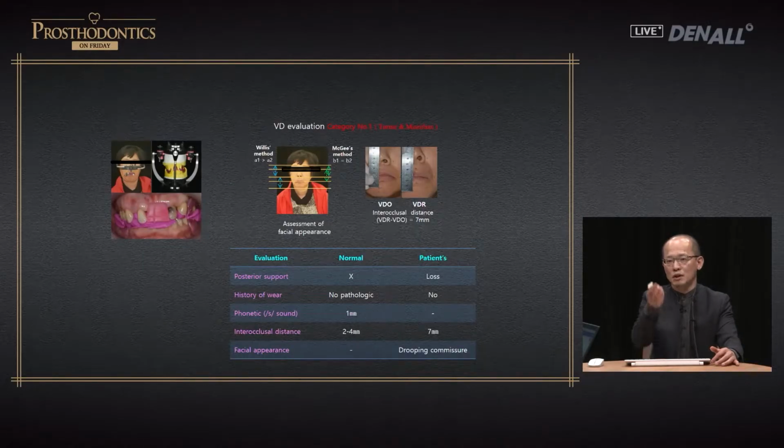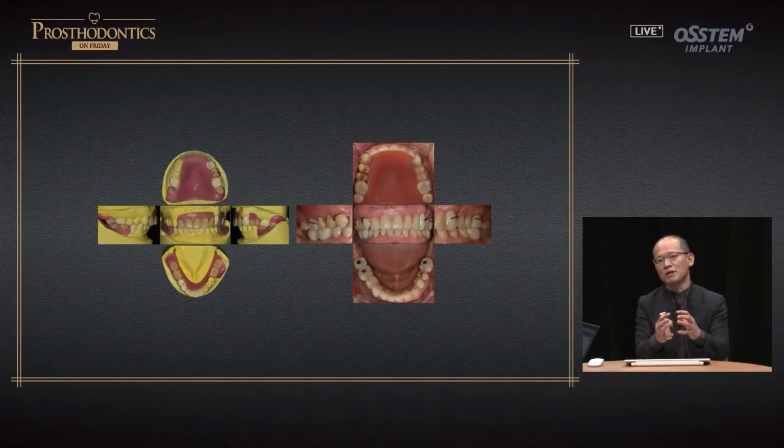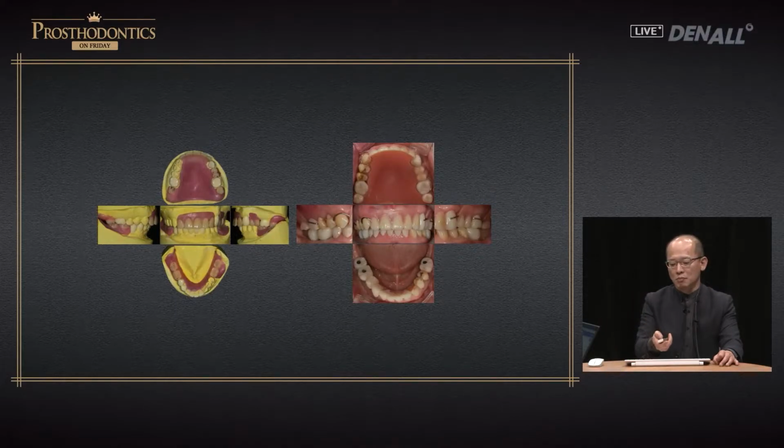So for another case, if you do evaluation, there are different evaluation steps. Based on that, again, temporization is a must. If you are not sure, then increase roughly based on the articulator. Of course, at a later stage, VD and CR will be done again, but provisionalization and temporization need to be there and need to be sufficient.